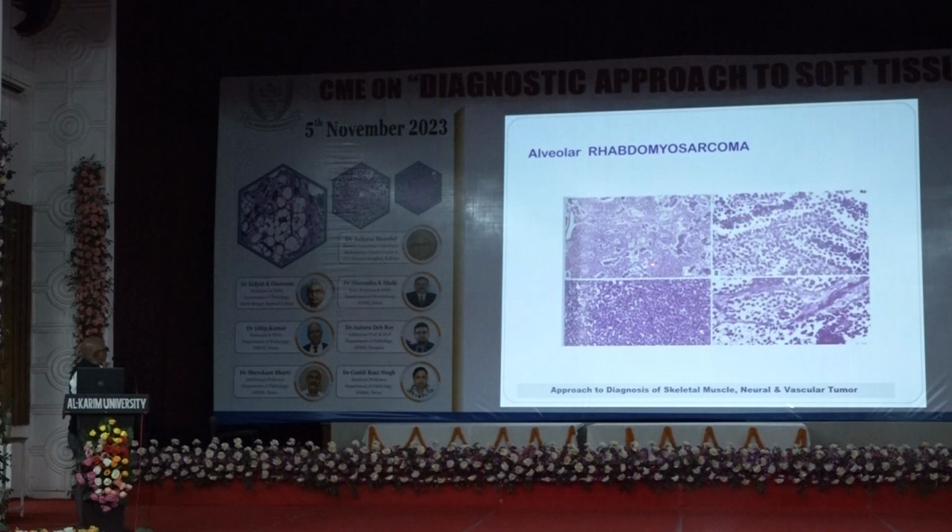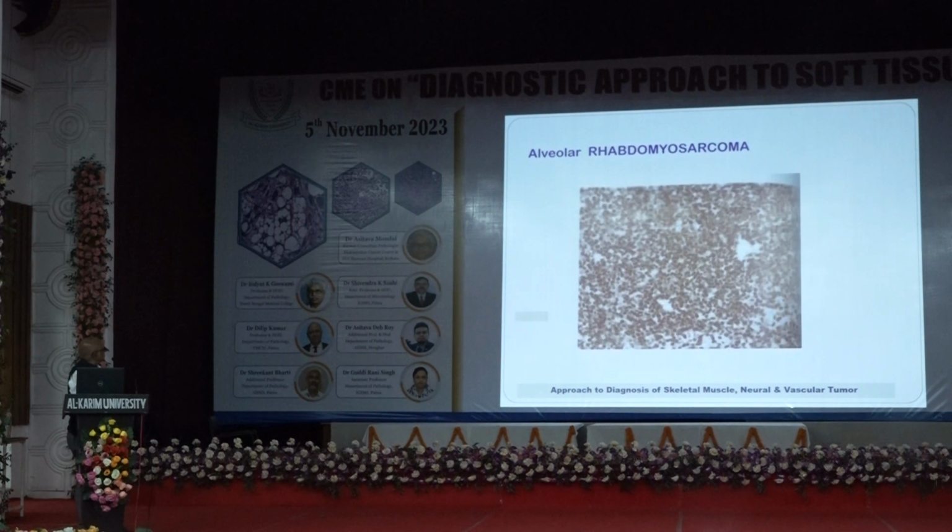See, these are all tumor cells. Here also there is a single line of tumor cells around the vessels. This is the compact one. There is a loss of cohesion of the tumor cells here. This is desmin positivity, dense, diffuse.